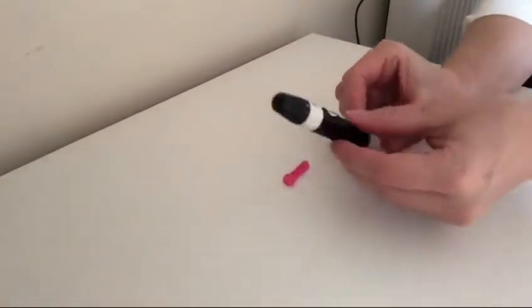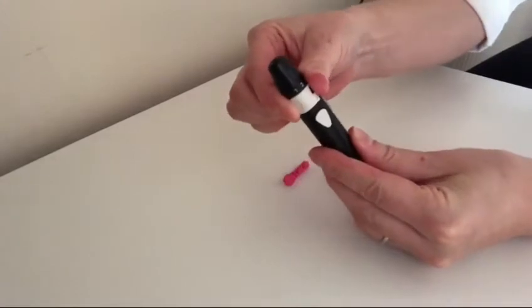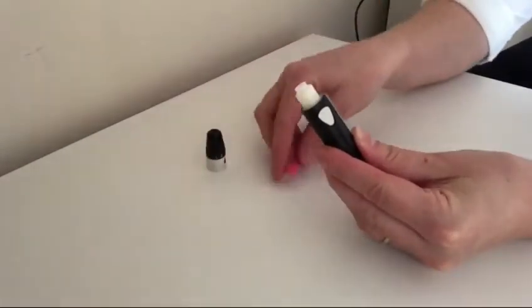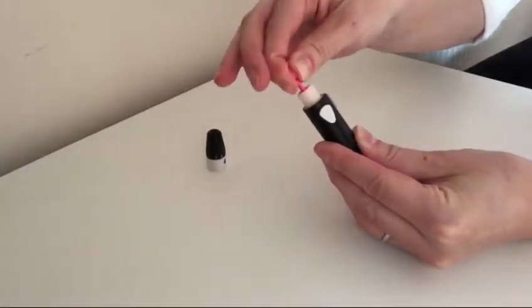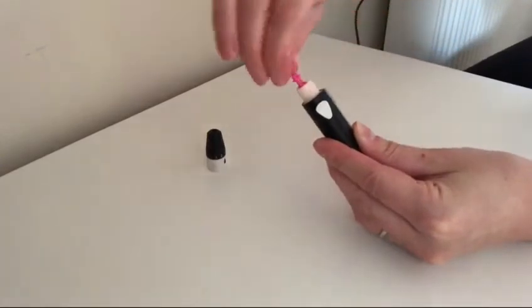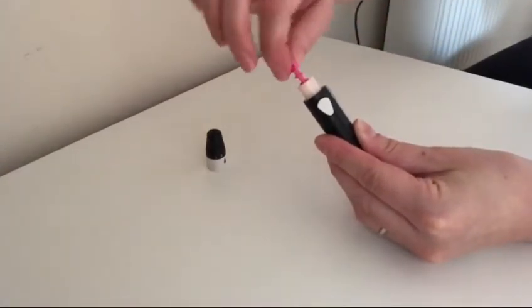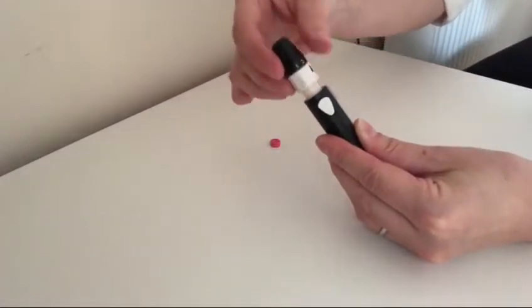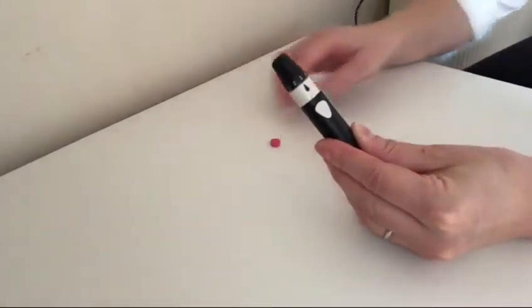To load the lancet into the finger pricking device, twist the end of the lancing device off where the white border is and pull the top off. Push a microlet lancet into the slot until it clicks and twist off the protective cap. This will expose the lancet. Now replace the lid to the lancing device by twisting it in the opposite direction until it clicks.